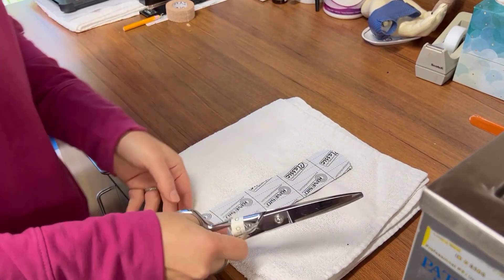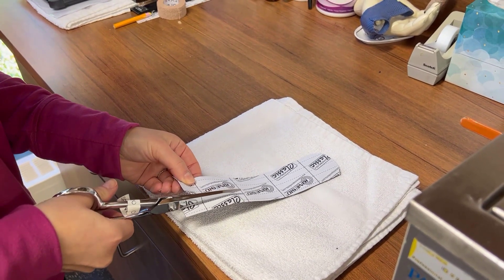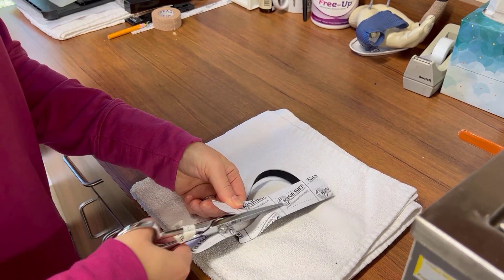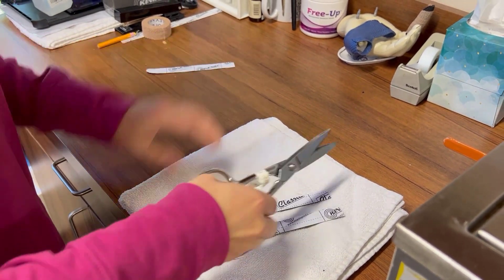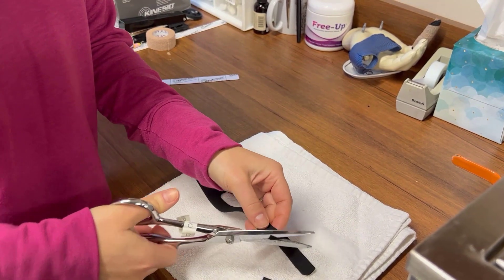First you will want to cut a U-shaped pattern in your tape to create two tails which will wrap around the wrist. Once your edges are rounded and the skin is prepped, you will position your patient for application.